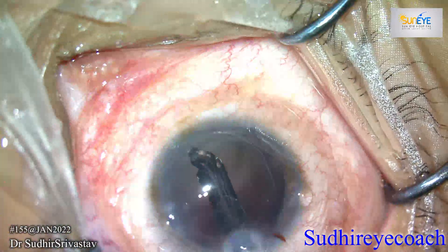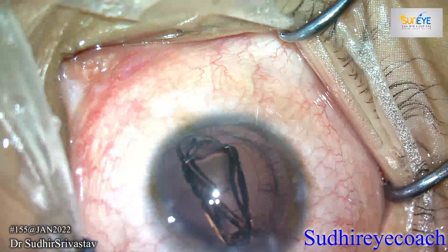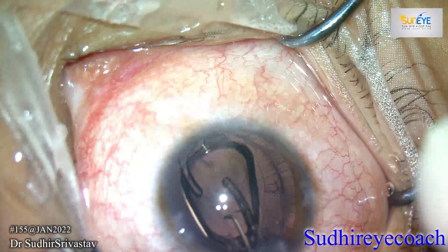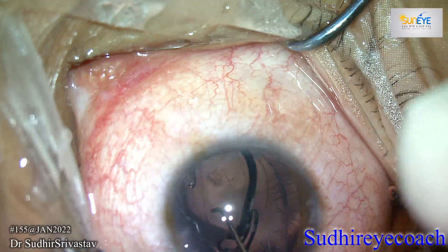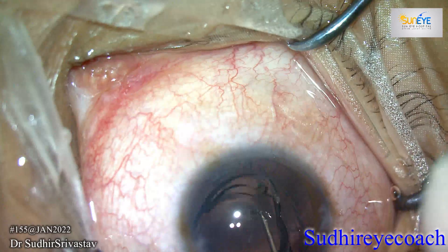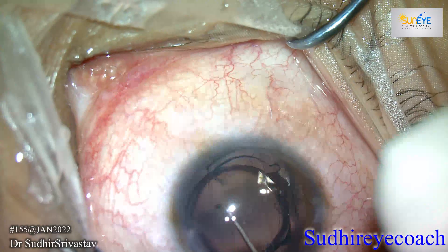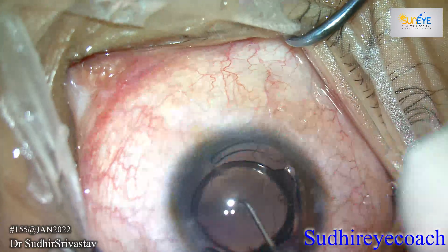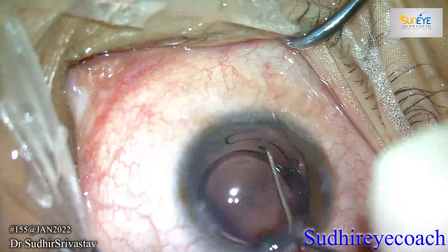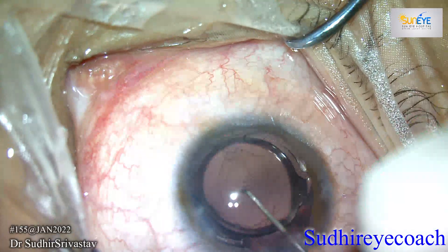Finally, I carefully implanted the hydrophobic IOL and placed it inside the bag. Although it was slightly difficult because of the limited space available in the bag, the implant was eventually well set inside the bag.